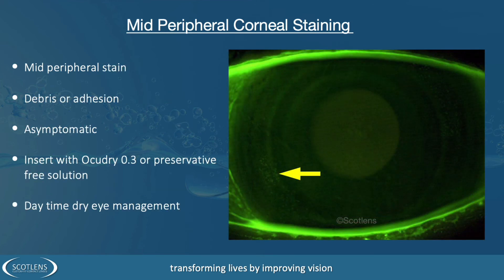If we see staining in the mid-peripheral area like we see here where the yellow arrow is, this is usually caused by debris underneath the contact lens or by adhesion between the lens and the corneal epithelium. It tends to be asymptomatic unless the staining is quite marked, in which case the patient may have foreign body sensation. This is treated with preservative-free drops such as Ocudry 0.3 and ocular surface management during the day — it's possibly an indication the patient has dry eye in their normal daytime environment.